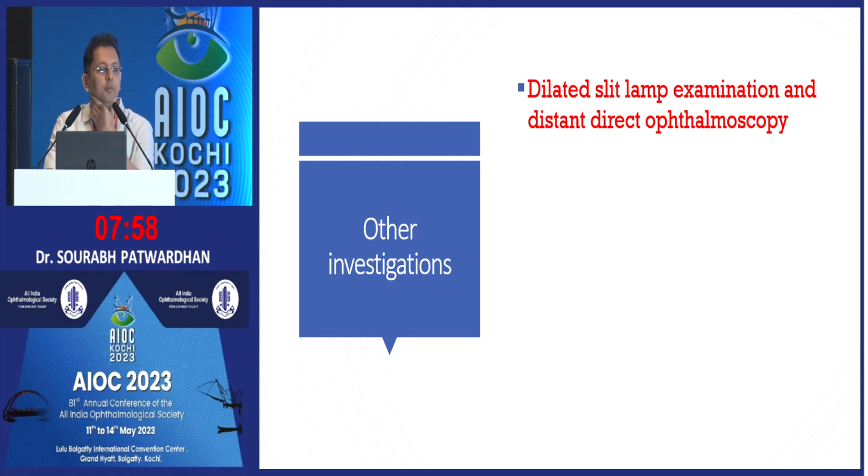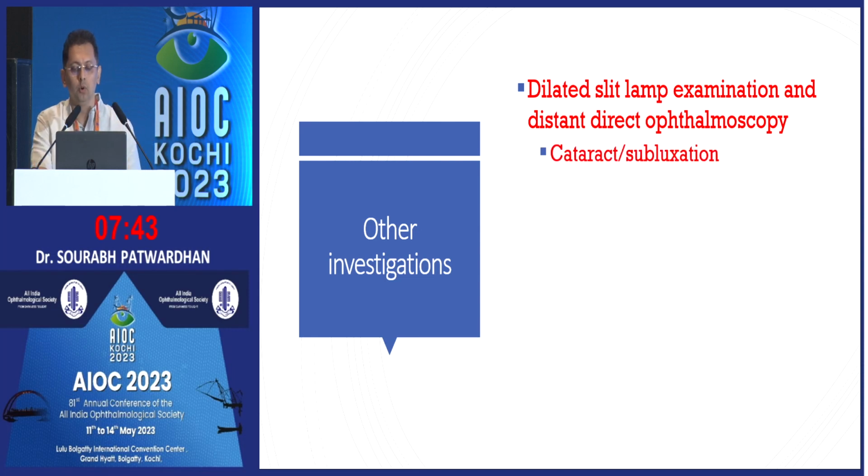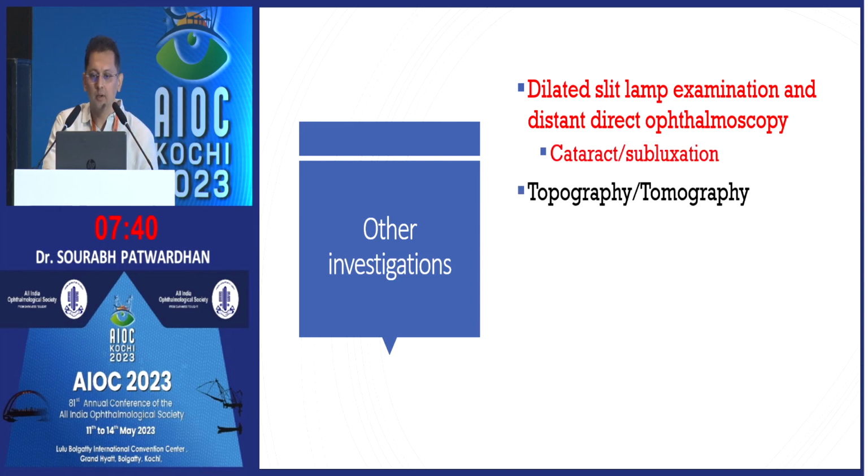Now, in case of slit lamp examination and distant direct ophthalmoscopy is very important, because you should not miss early signs of cataract, because some of these patients may have cataracts, and if you miss it preoperatively, postoperatively it may be a problem. Make sure that you examine thoroughly.